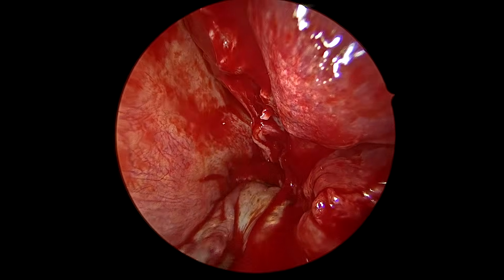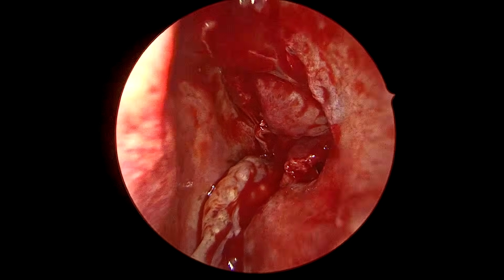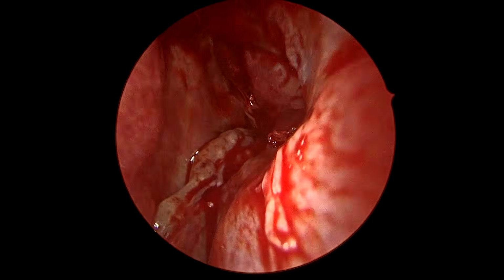You see the mass. This is the mass basically. It is extending to the posterior fontanelle also.